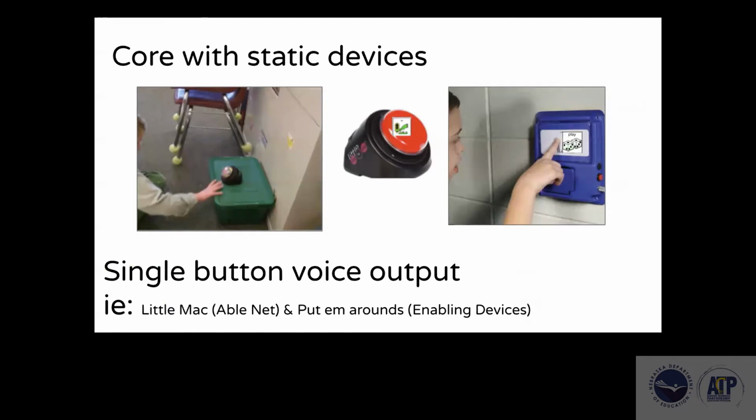One option is, with some of our students, we usually start out with as many words as we can, and then we'll adapt from there. Some students, it's just too much. They really need to learn the concept that I press this, I get that. And so we've actually had to take a step back, but in the end, it really helped them by just putting individual words or phrases, core-based phrases, on single voice output devices. These are just a couple of examples of ones that we use.